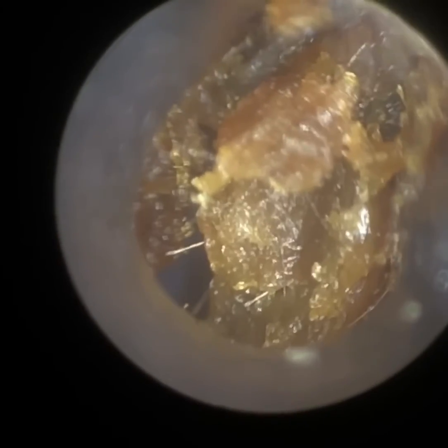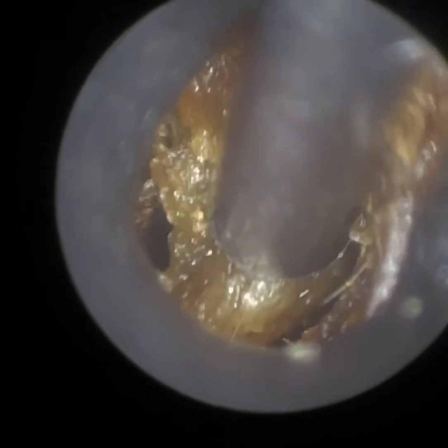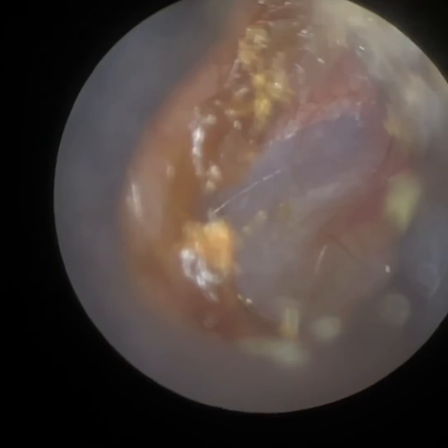Even at this stage, the patient can hear significantly better because the wax is no longer on the eardrum — this was directly impacted on their eardrum. I'm just slowly bringing it away. This now provides a clear line of sight from the entrance of the ear to their eardrum, which you can see.